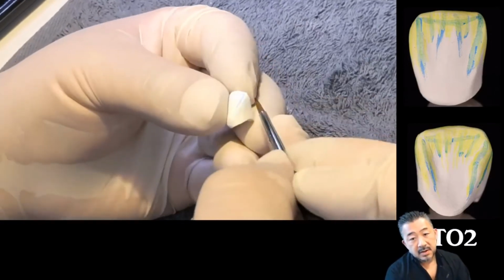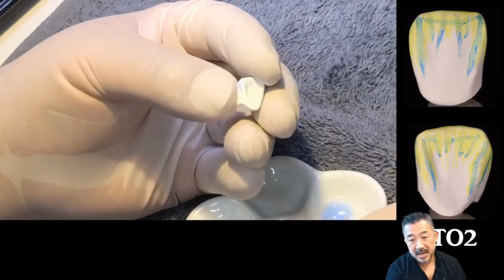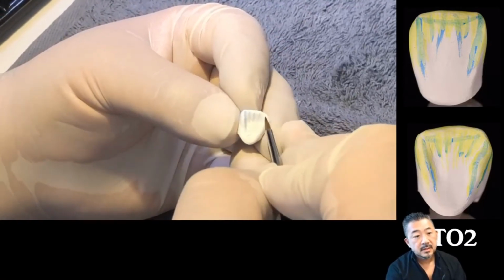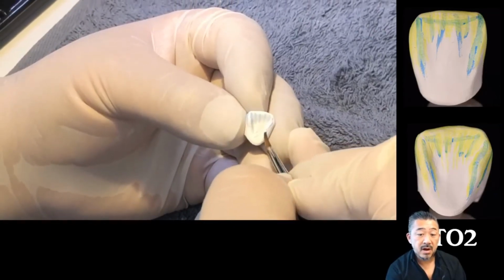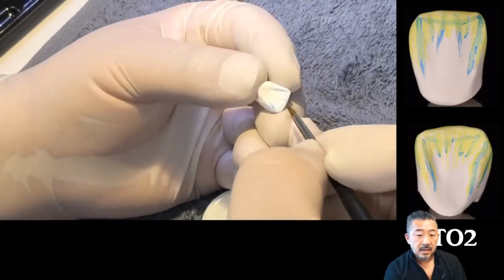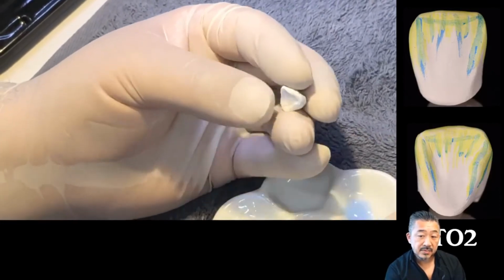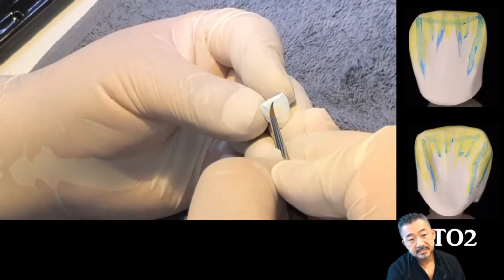Apply on the labial, mesial, distal and palatal side in the same way. The screen on the right is also blue. And apply lines on the labial and palatal side as if you were drawing a horizontal line.